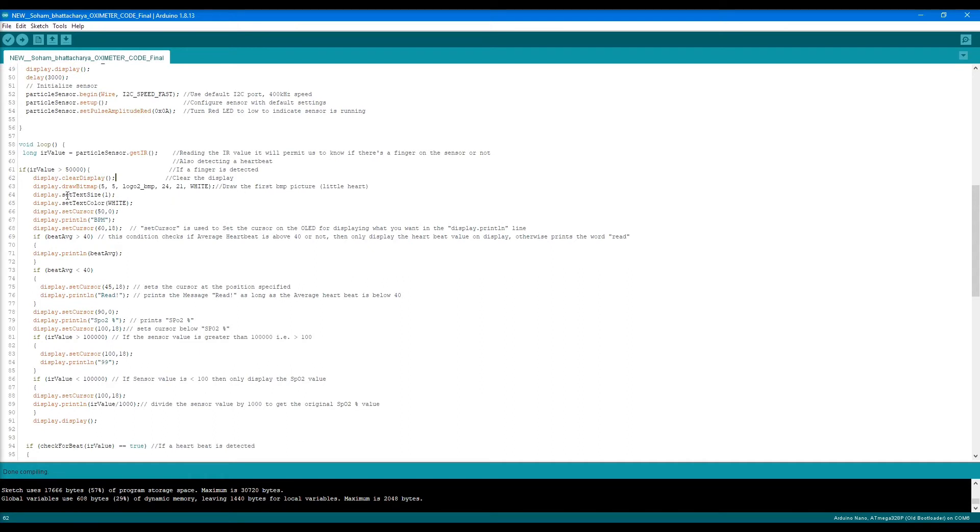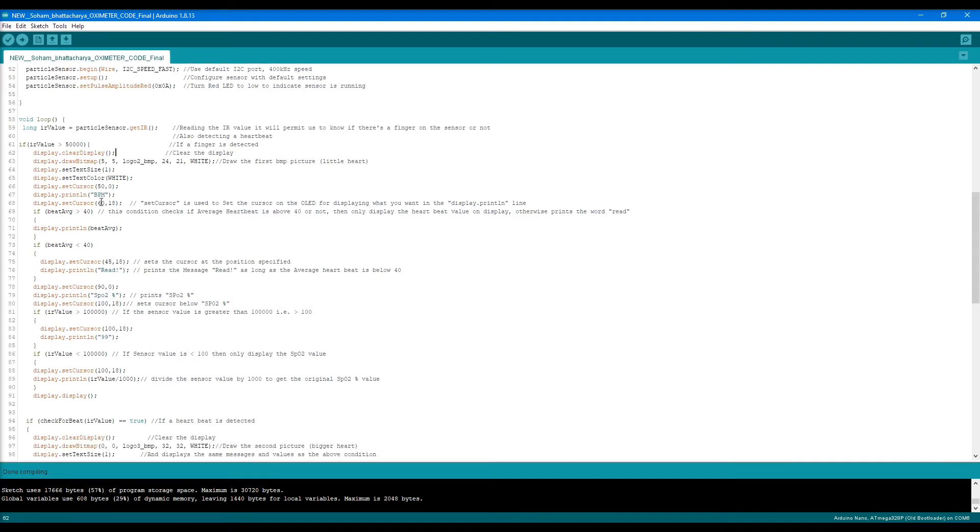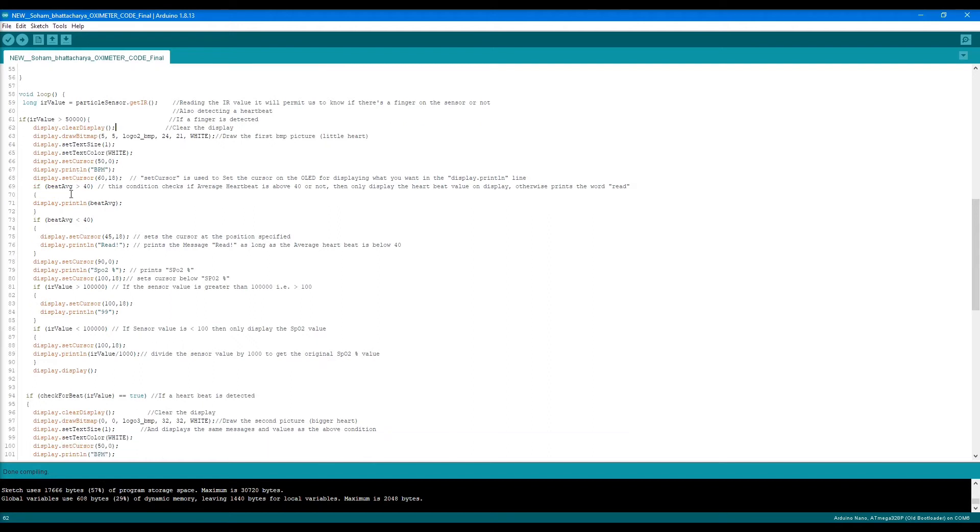Then we clear the display and draw the first bitmap image, the smaller one. We set the text size and color. The color isn't necessary for my display, but I kept it for generalization. Then we set the cursor and write BPM.